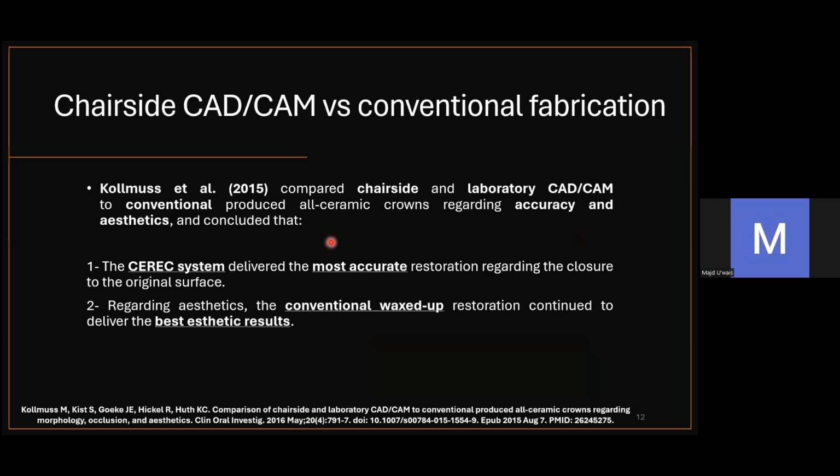And I mean by accuracy, the full accuracy and fit of the crown, not just the marginal fit. And they concluded that the CEREC system delivered the most accurate restoration regarding closeness to the original surface. Also, regarding aesthetics, the conventional wax-up restoration continued to deliver the best aesthetic results.